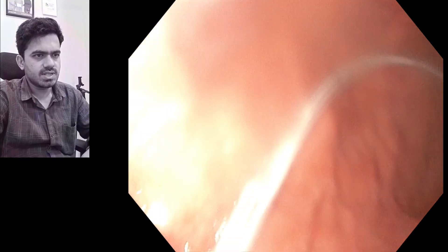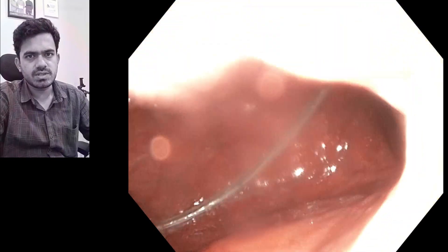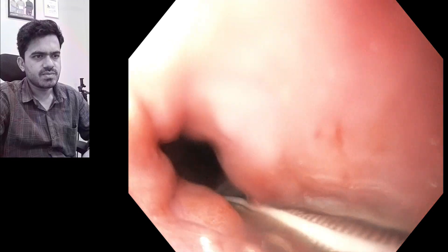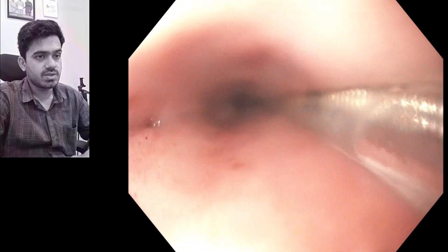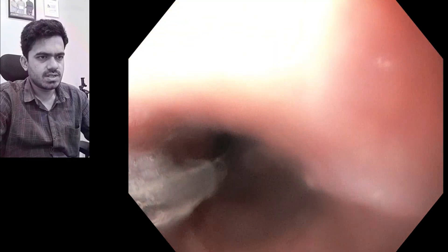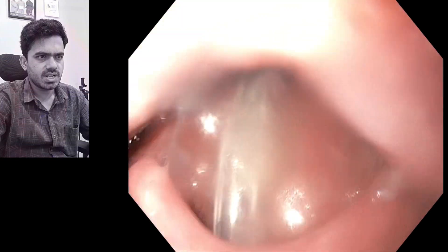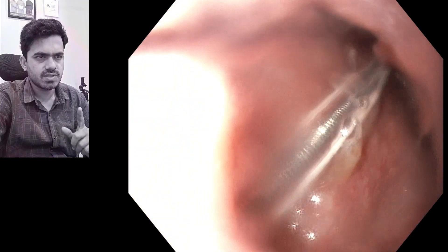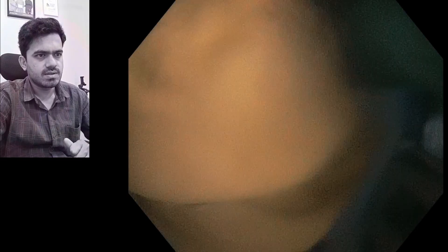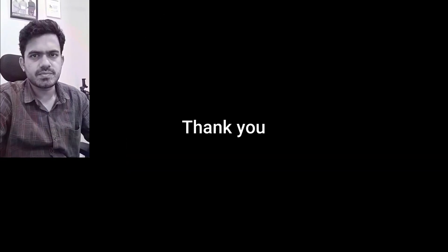This is the visual confirmation that the tube has gone into the stomach. Now we slowly pull out the scope, making sure that we don't pull out the tube along with it. By gentle movement it is taken out, and you can see it is passing from the pharynx into the esophagus without any kink. In the end, we are going to secure it to the nostril. Thank you.